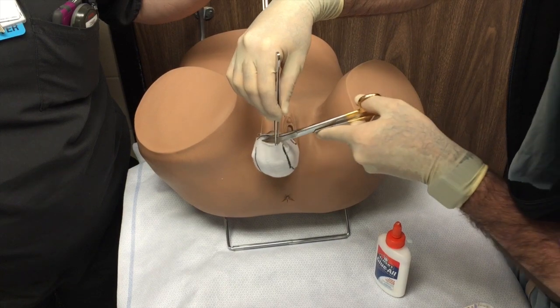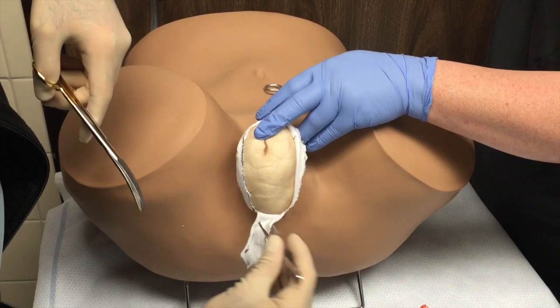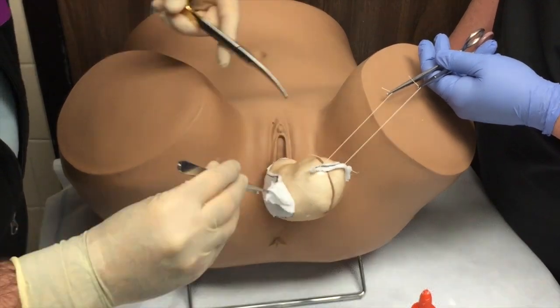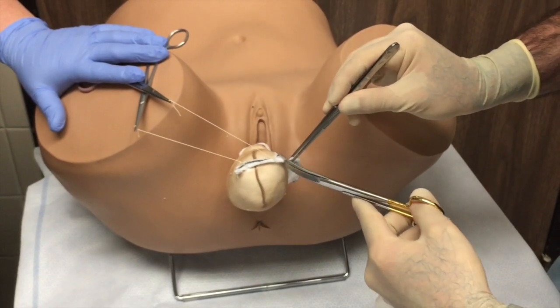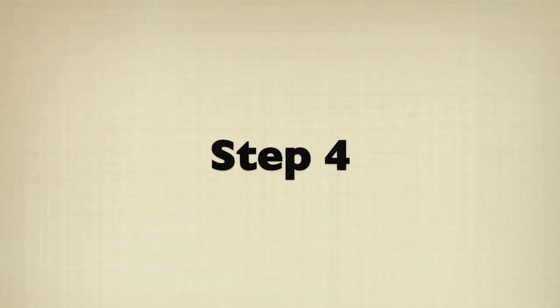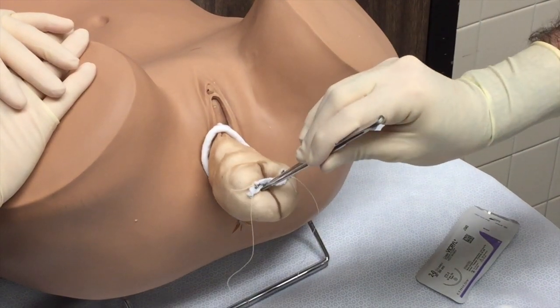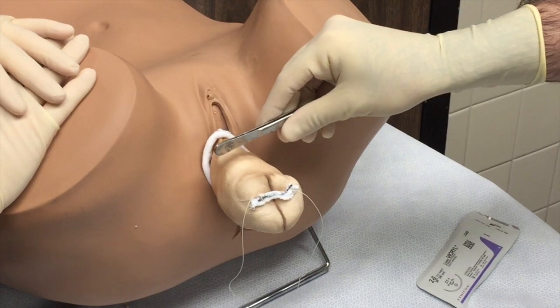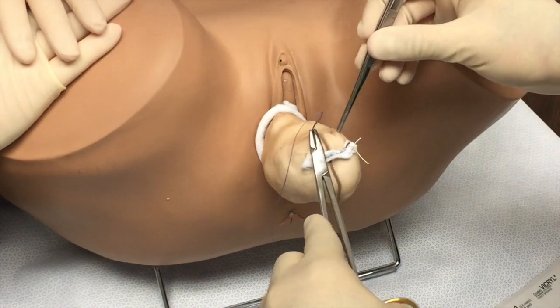The sides are then excised bilaterally. In this model we use Mayo scissors, but Metzenbaum scissors can be used as well. Care is taken not to enter the peritoneal cavity or the lumen of the pantyhose. Once all the epithelium is denuded, we begin purse string suturing of the fibromuscular connective tissue using a delayed absorbable suture such as 2-0 Vicryl, creating an intussusception-like tunnel.